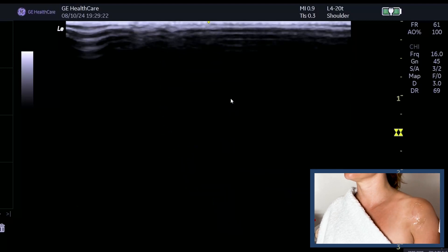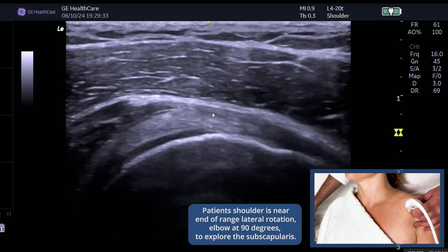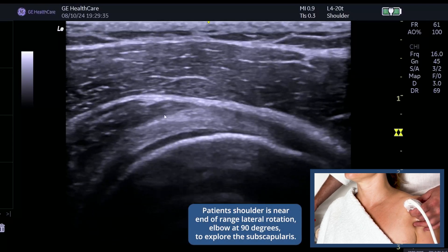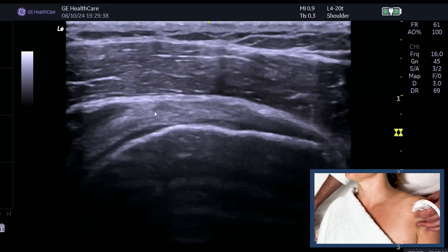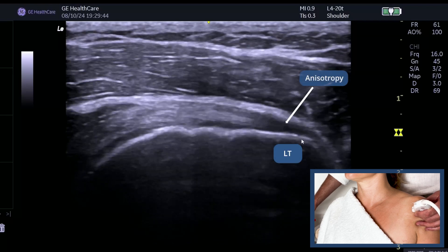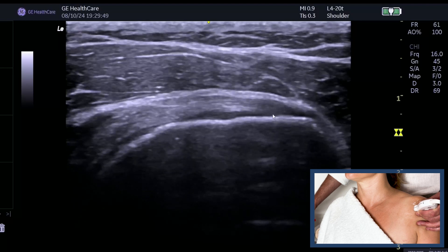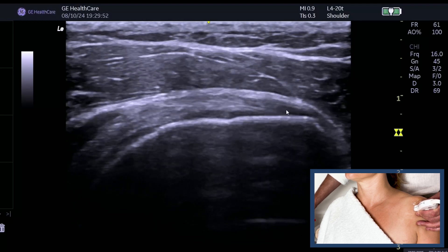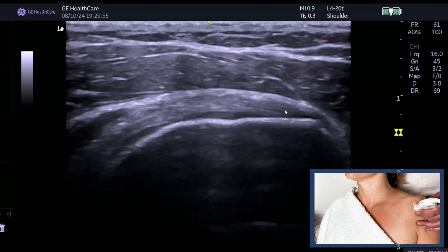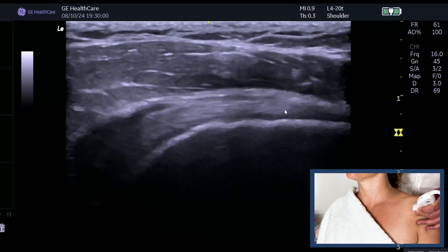I'll give you one more example. Remember, subscapularis is the most missed rotator cuff tear on ultrasound. If we put the patient into lateral rotation, you can see the subscapularis musculotendinous junction. The same thing happens — remember the change of direction before those fibers attach into the lesser tuberosity. So again, we must heel down the probe, and then we can see those fibers nicely filling in, which again means it's anisotropy and not a tear.